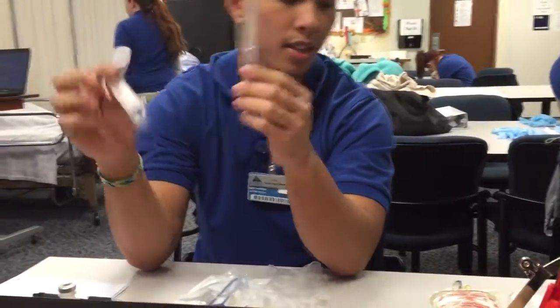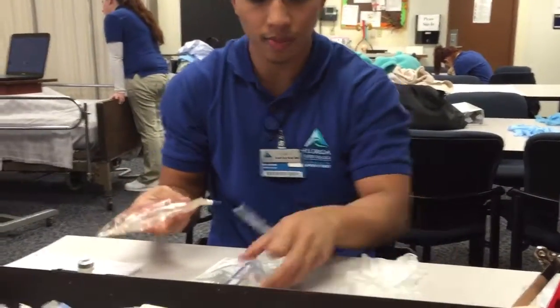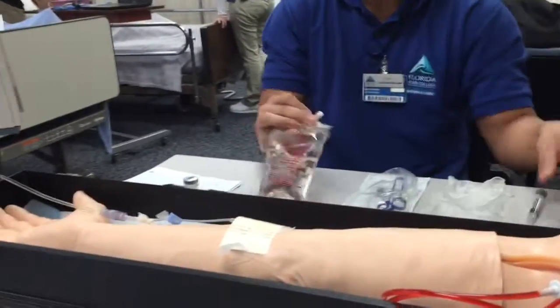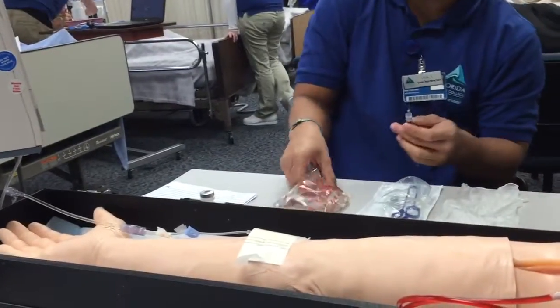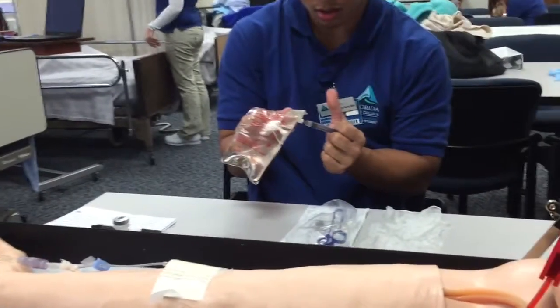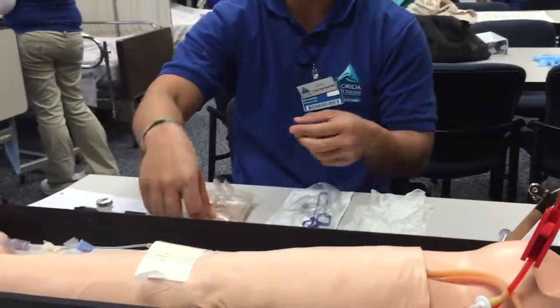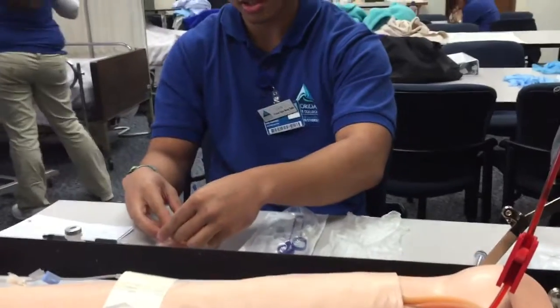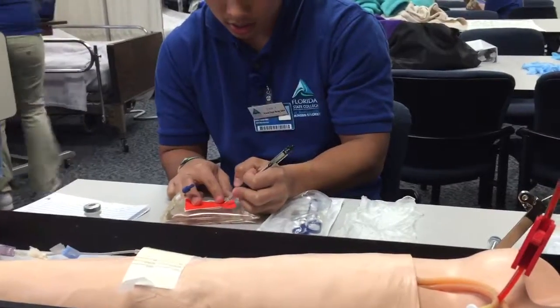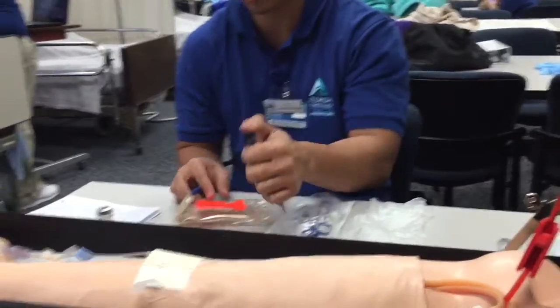This is sterile because there's a cap on there. And this is the mini bag that we're going to administer the medication through via piggyback. So once again, we're going to clean the site right here with alcohol. We're going to inject the medication in there. That's good. We're going to dispose of our needle into the sharps. Then we're going to label the medication that we added to it. We're going to write the dose, the drug, the amount, the date, the time, and the patient, along with my initials. So now this is good to go.